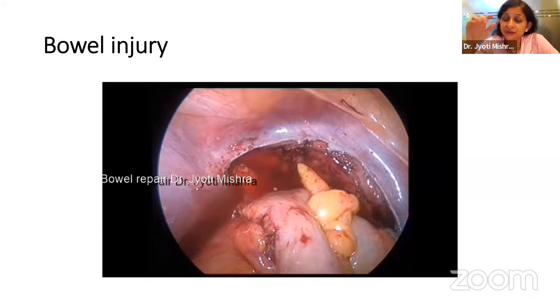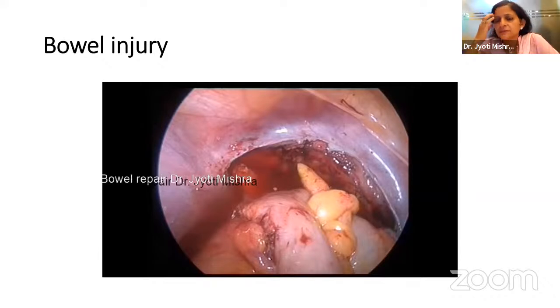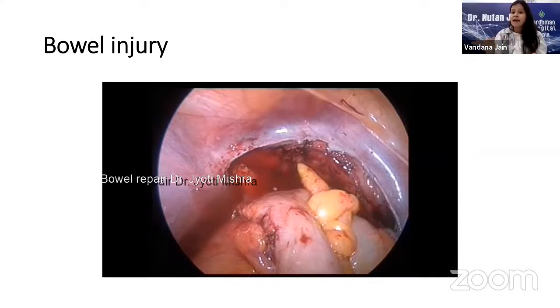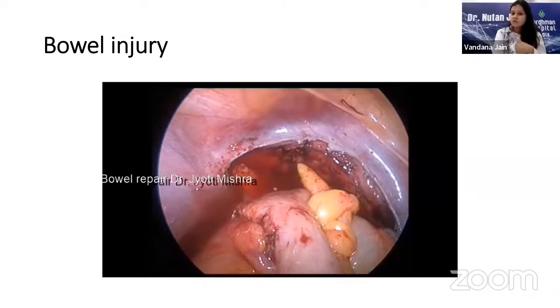But should we do stenting in all cases where we don't see a jet? Not in all, but yes, if they're suspecting, and if it's dense endometriosis, cases of DIE, endometriosis with uterus or with dense adhesions. And ma'am, for the jet, we can give pyridium a day before or in the morning, so the urine gets orange. Also, when you're doing cystoscopy, deflate and remove the gas, so the compression on the organs decreases. And sometimes if the blood pressure is stable, ask your anesthetist to give a little bit of Lasix. So in our cases, 99% of the times we are able to see the jet, which is reassuring for the patient and for the surgeon.